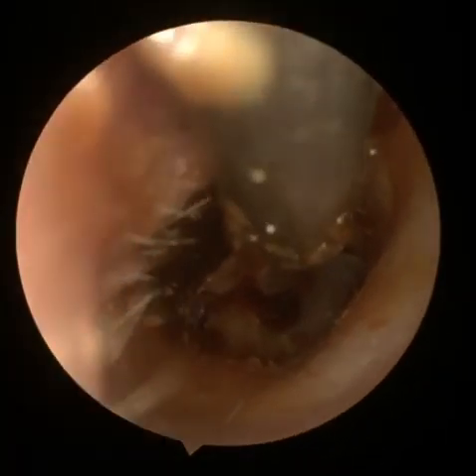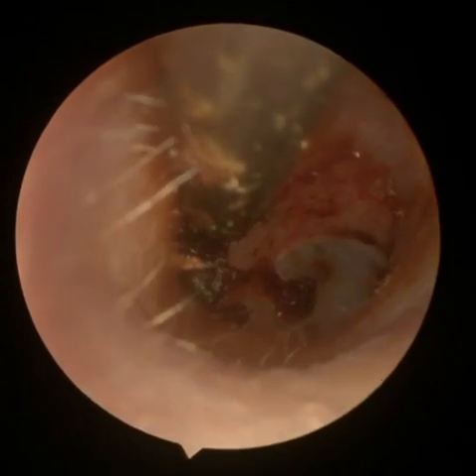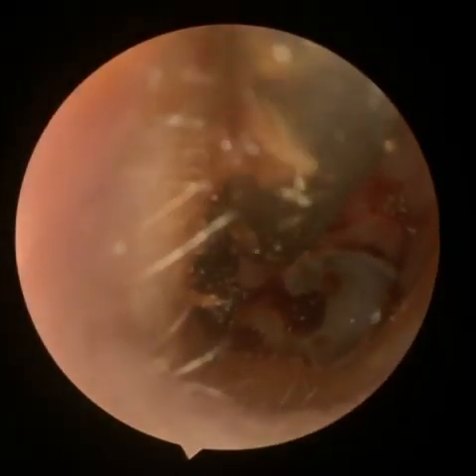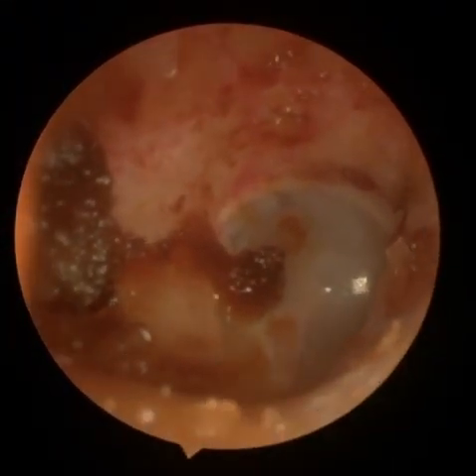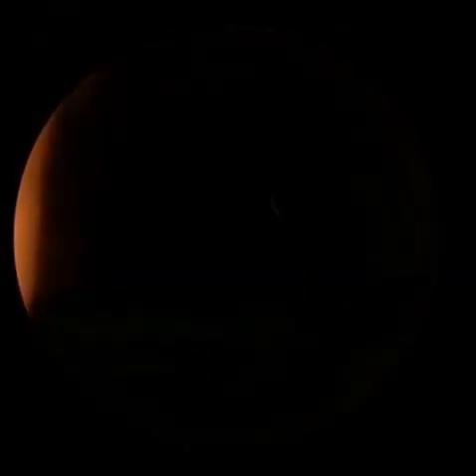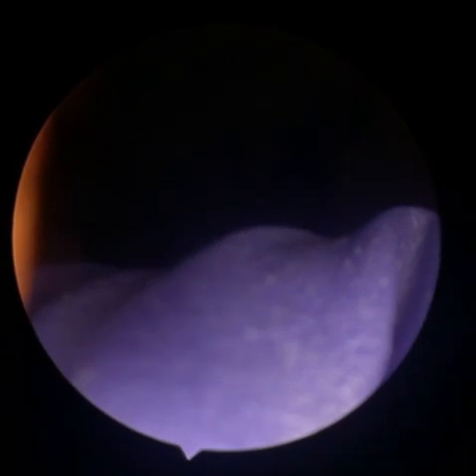That's been removed from the drum now, so we're just removing the rest of the debris along the cavity. It's not always important to remove absolutely everything — a little bit of wax left in the cavity is not a problem. We're going to remove that last little piece, and this is where you're really going to see how fragile that drum actually is, what a thin membrane it is, and how careful you actually have to be as I remove that last piece of wax from the drum.